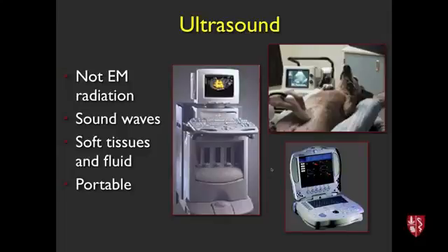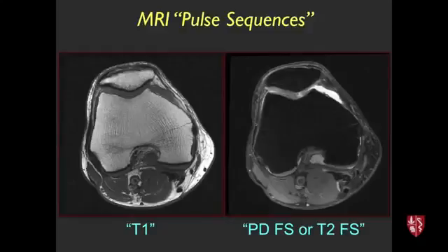Question? Go ahead. So T1 goes towards water or fat? Well, they both show both. So if I go back to this, I'm wondering what the second one is, what specifically the contrast goes to for both of those options.